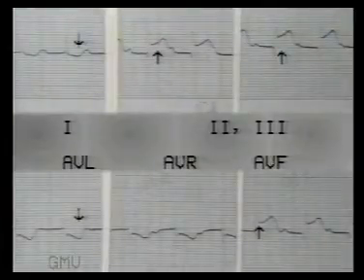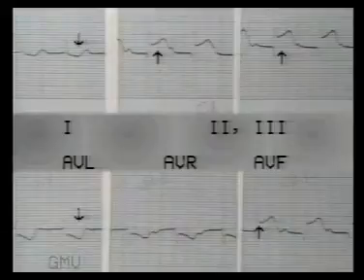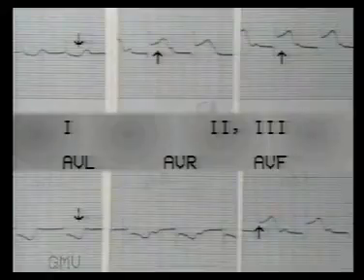In this ECG, note the marked ST elevation in leads 2, 3 and AVF. There is reciprocal ST depression in leads 1 and AVL. This is an inferior wall infarct. The ST elevation with upright tall T waves indicates that it is fresh, less than 1 day old.